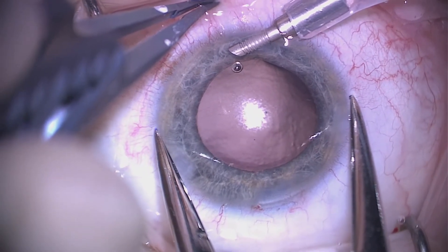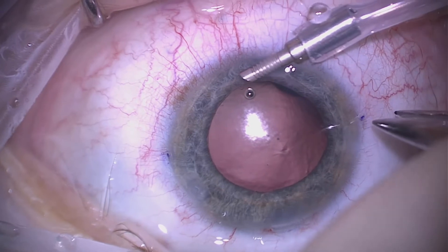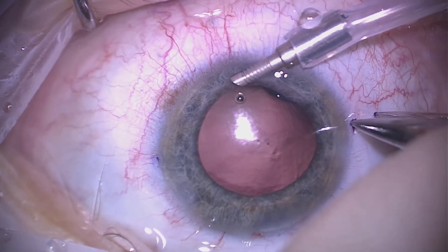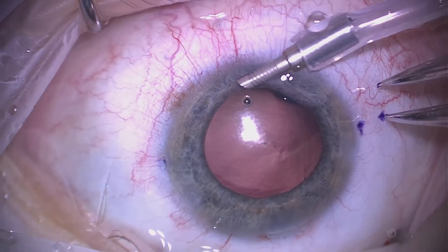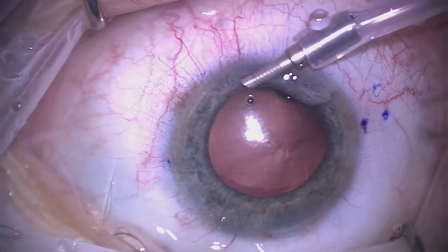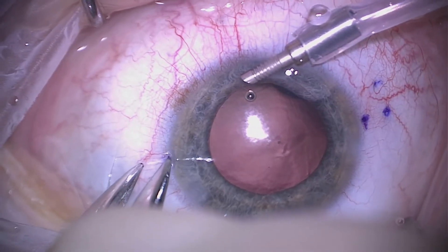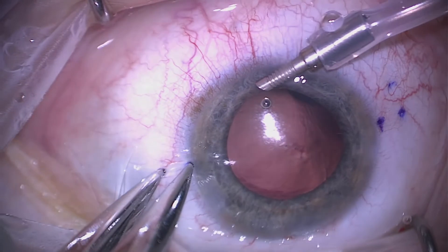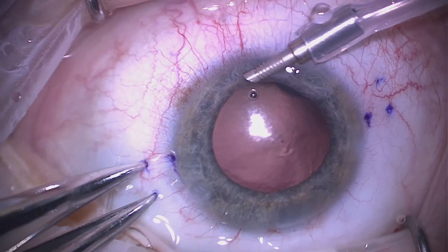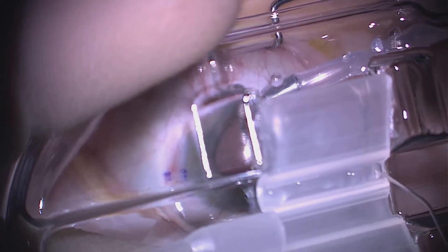I'm marking 180 degrees apart here for Yamane fixation of a scleral lens. We measure back a couple of millimeters from the limbus and then another couple of millimeters back from our original mark to create the tracks needed to sclerally fixate the three-piece lens. We then use a ZA9003 Tecnis lens — I think this is a very nice lens for the Yamane technique.